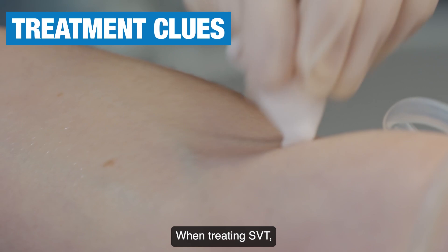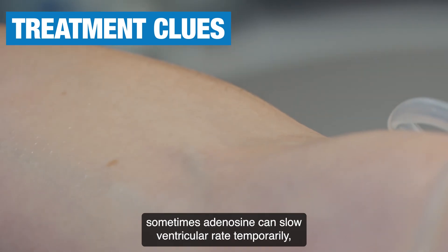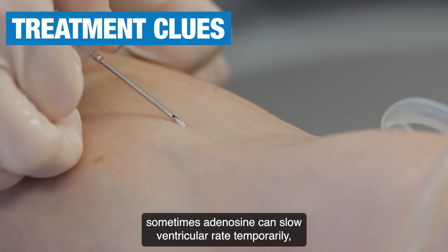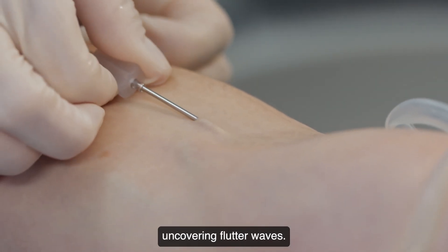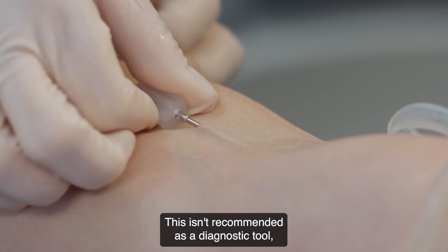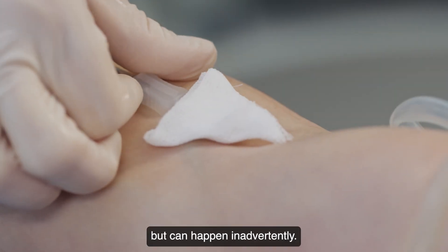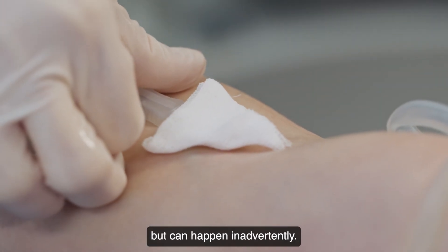When treating SVT, sometimes adenosine can slow the ventricular rate temporarily, uncovering flutter waves. This isn't recommended as a diagnostic tool, but can happen inadvertently.